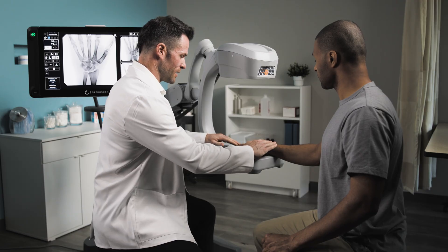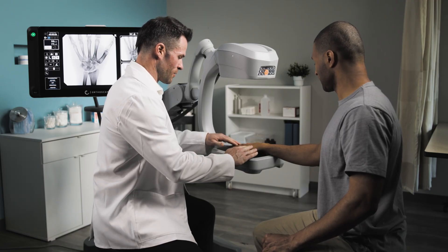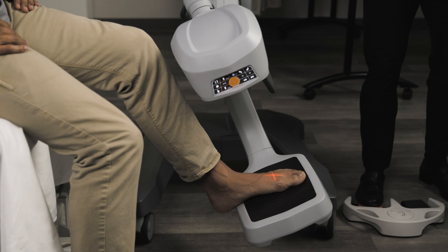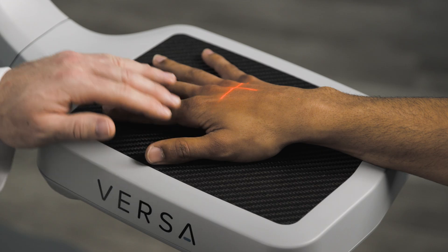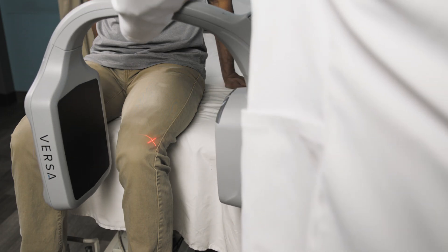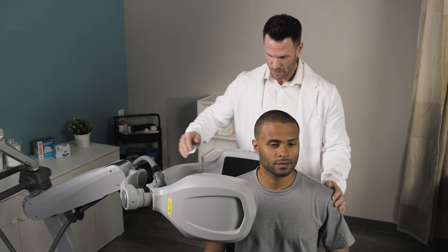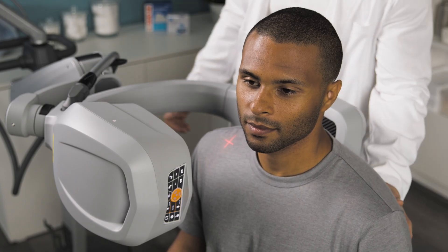Designed specifically for clinical environments, Versa enhances workflow efficiency while improving patient satisfaction. Versa provides the best in extremity imaging, including feet, hands, knees, and shoulders, while ensuring patient comfort. Improved arc depth and a compact footprint ensure optimal positioning during procedures.